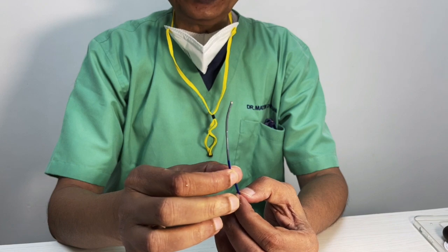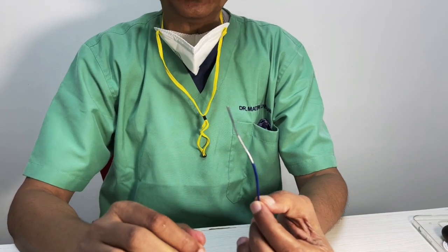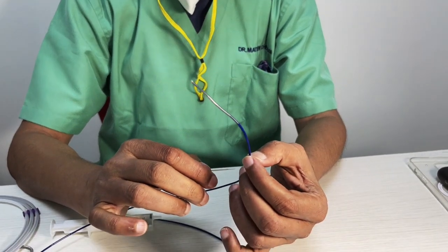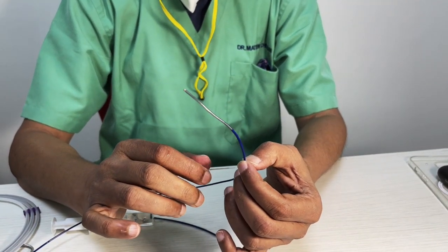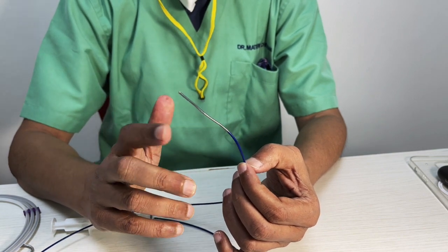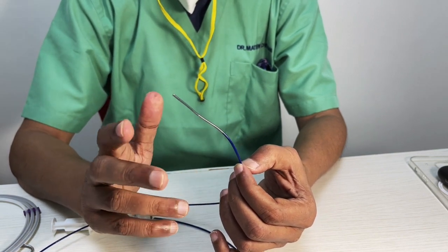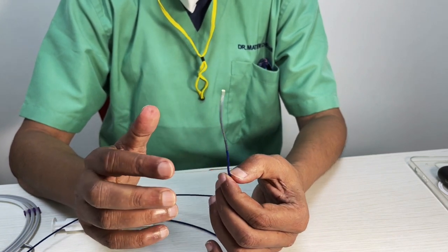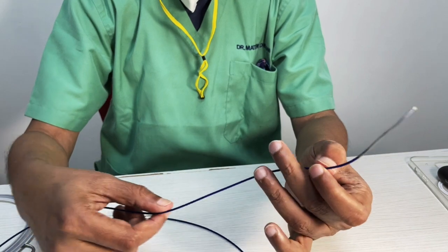Now, the advantage of Cat 5 is that it comes in multiple lengths. You have a 105 length, which is the one you would use if you want to do intracranial stenting. You can even do a coiling, or you want to put a device like a web device, or a device like the contour. All of these will do very well because it's extremely trackable.